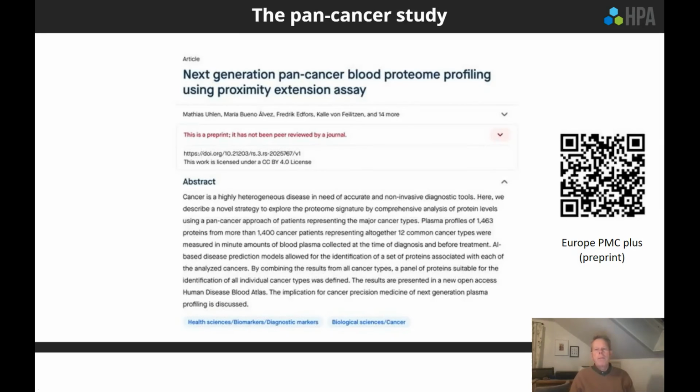Well, first of all, maybe I should say that we're collaborating with a company here in Stockholm where you actually take a blood sample at home and you send it by mail in a dry blood spot format, which allows people to sample themselves at home and send it by mail to the lab and get the results.